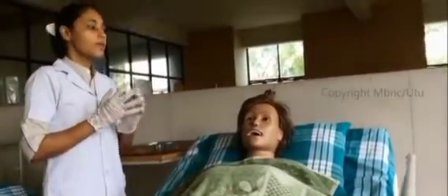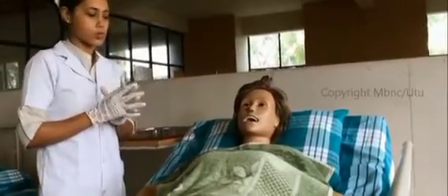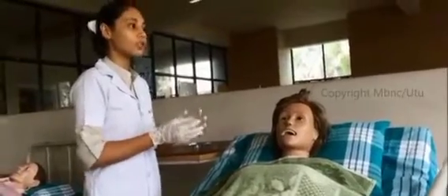Then, it is a clean procedure, so I have worn clean gloves, because when we are inserting, there is a chance of fluid contamination. So for the prevention of cross infection, we have to wear clean gloves. Now after the comfortable position, we are going to do the NG tube insertion.